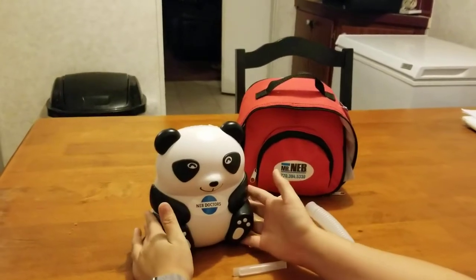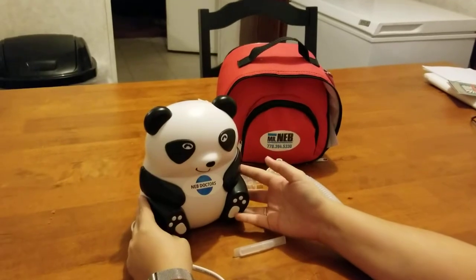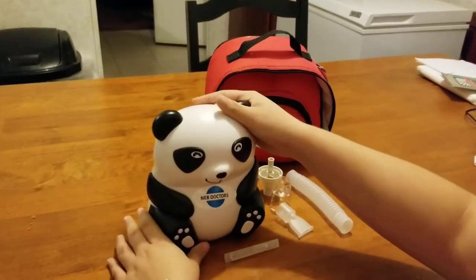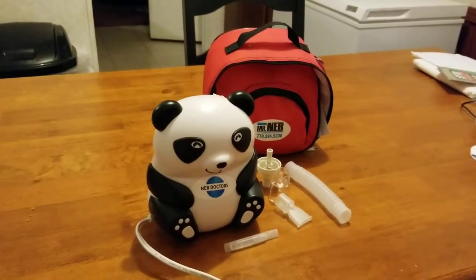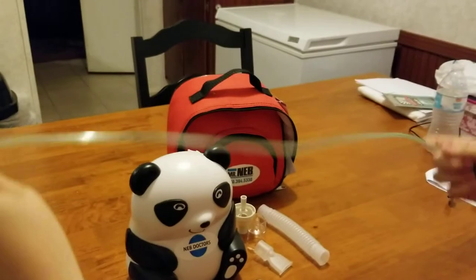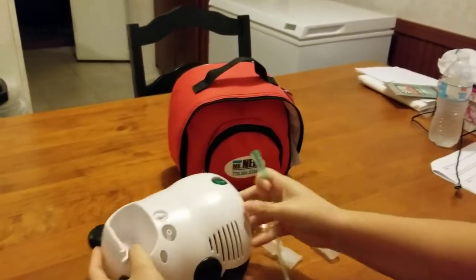This is a video on how to assemble my nebulizer, which is an at-home breathing treatment machine. Here's the nebulizer itself, and this is the tube that the medicine runs through, so it hooks into the back right here.